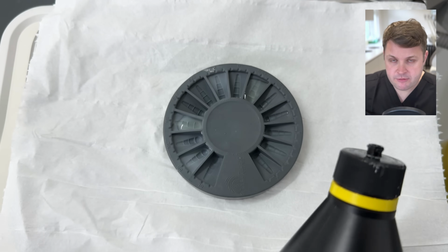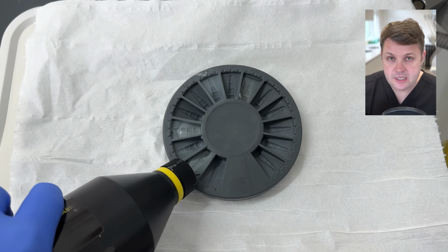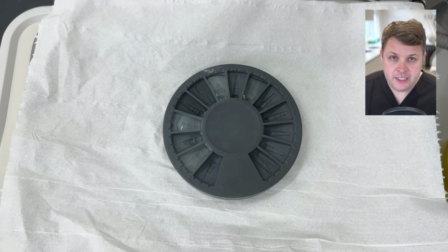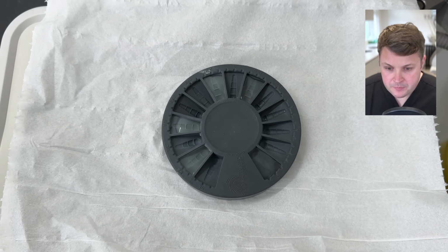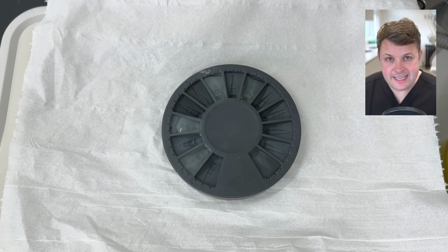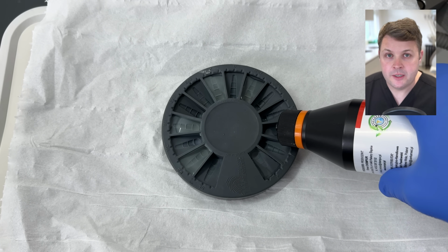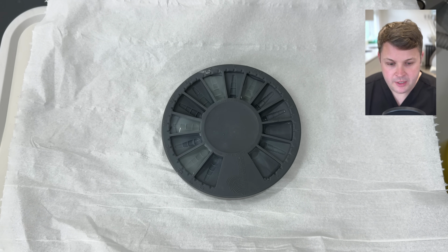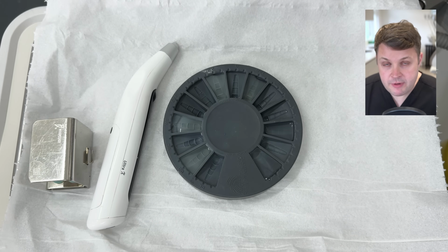This tray table's too dirty. We're going to remove all the dirty instruments, give it a bit of a clean, and get my disinfection ring out. I'm going to place bleach in the MB1, MB2, DB and palatal wells. Once we've placed the bleach, I'm going to use EDTA at some point, which is going to be in another well. And then we're going to use isopropyl alcohol. This is to prepare the cones ready for our obturation. And then we get our instruments out, ready for the obturation.